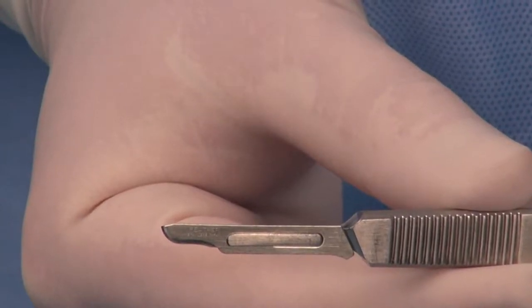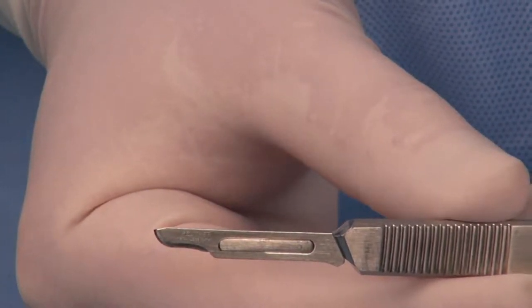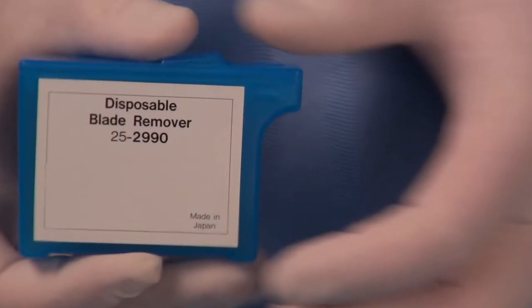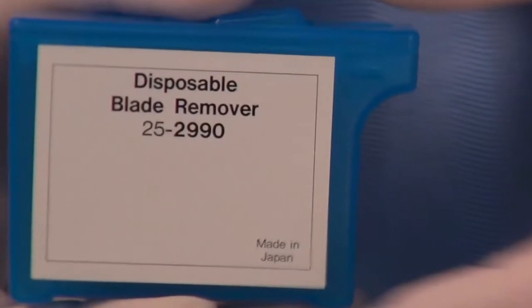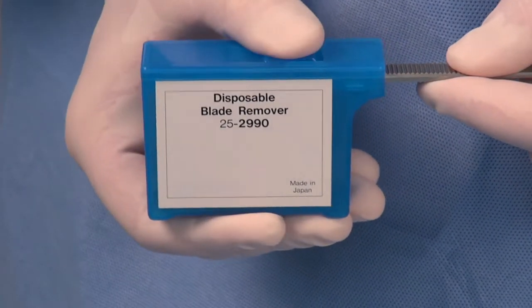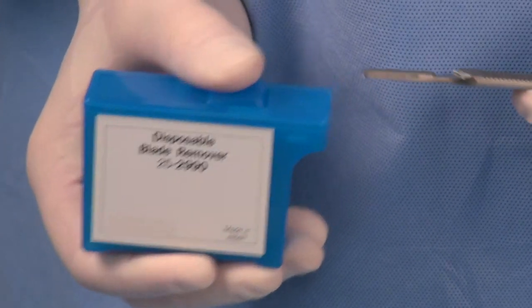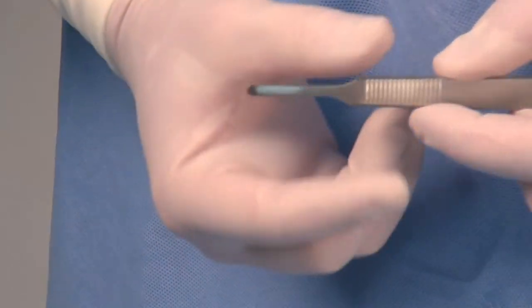Having a safe and easy removable method of used blades is extremely important to reduce dangerous exposure to the blade, which can result in a sharps injury. Our palm-sized, puncture-resistant, disposable blade remover can remove used blades from any size or type of scalpel handle. To remove a blade, insert the scalpel into the blade remover slot as far as it will go. Lightly press the button on the top of the dispenser and pull the handle out. As you pull the handle, the detached blade will drop inside the blade remover.